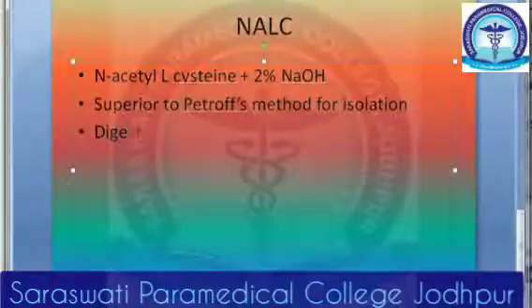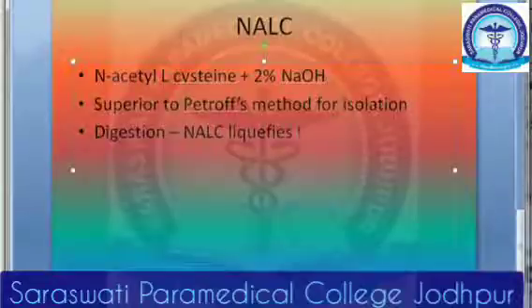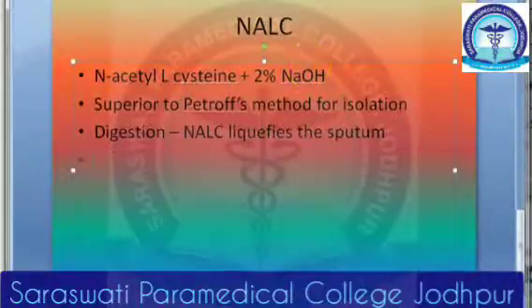So how do you digest? NaLC liquefies the sputum. Are you awake, people? Because I am just telling and typing, I think you are sleeping, right?